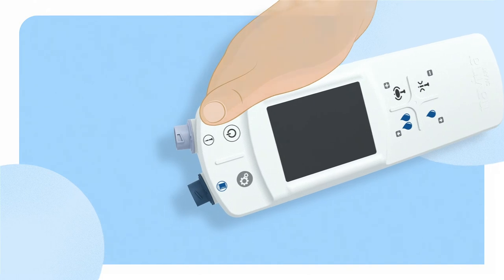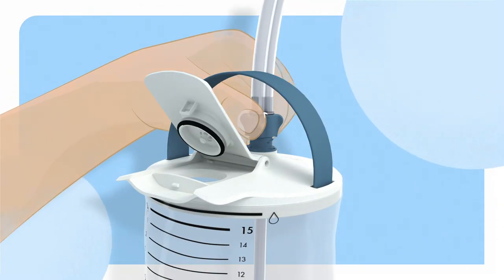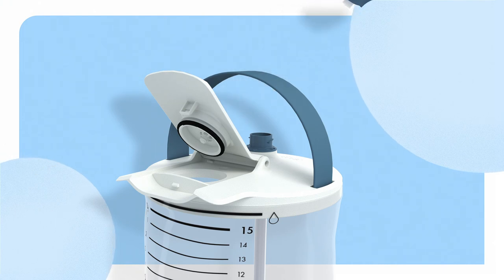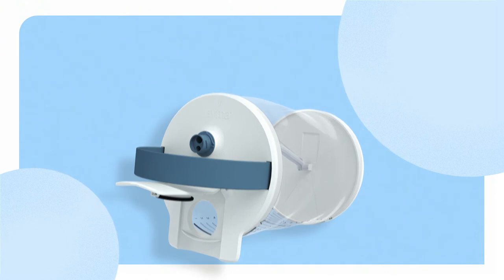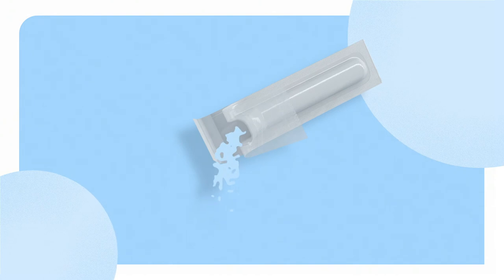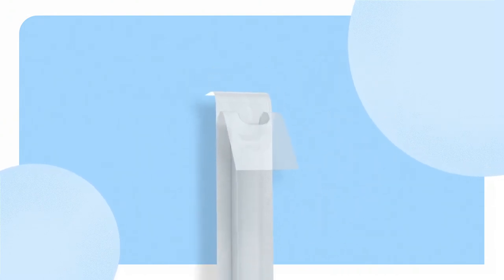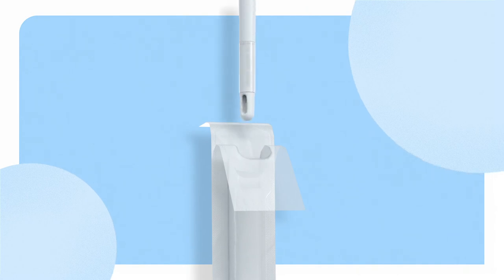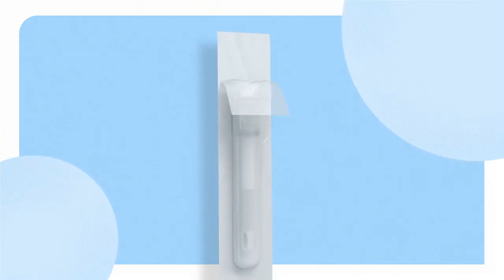Next, we have the water container. Remove the dark blue connection from the water container and empty the remaining water. Lastly, we have the rectal catheter. Empty the catheter package from water. Holding the tube with the white connection, place the catheter back into the package. Now disconnect the rectal catheter from the tube and dispose of it with its package with household waste.